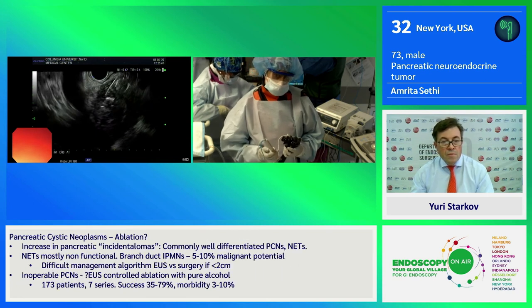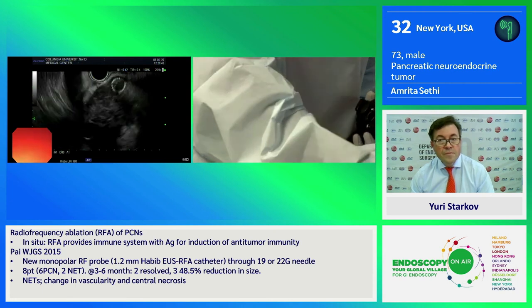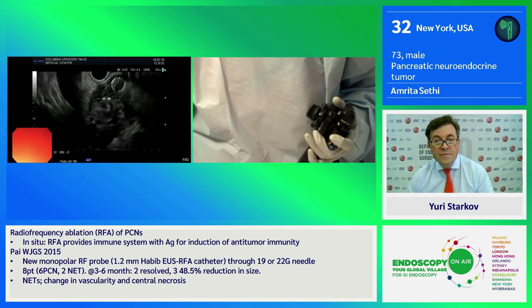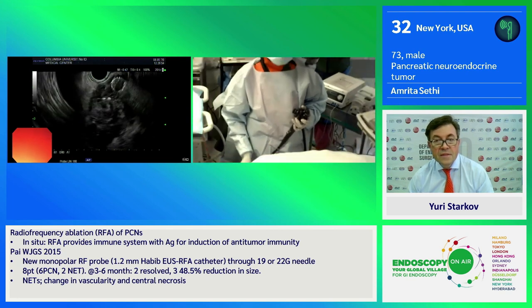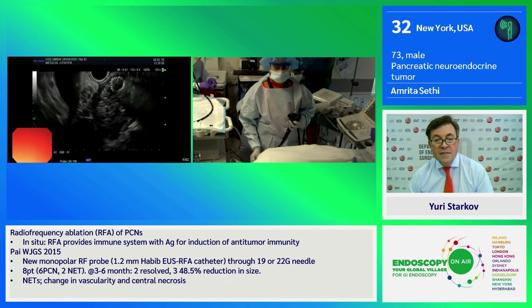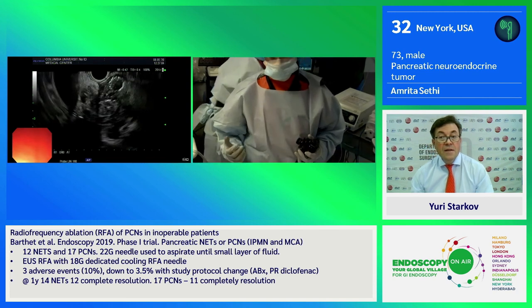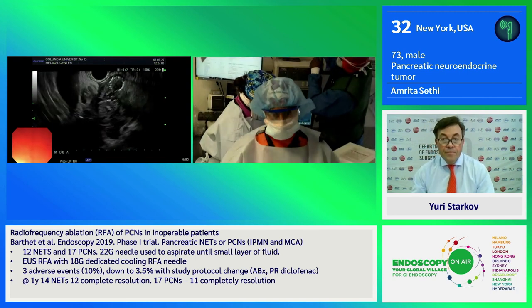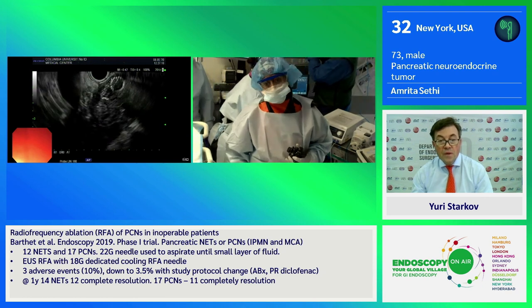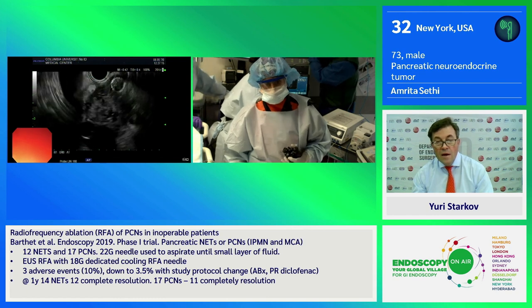Now I have treated the areas that I can access, so I'm going to come out with the needle. So that is this case. Since this patient does have an indwelling biliary stent, my team will exchange the stent out and just clean the ducts. Interestingly, we did talk to the patient that at another time we might also consider biliary ablation with an intraductal RFA catheter as well.